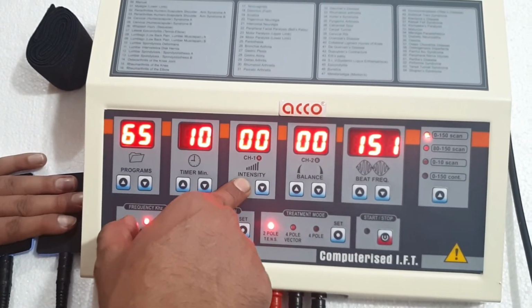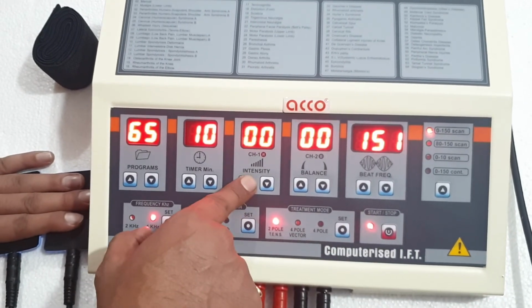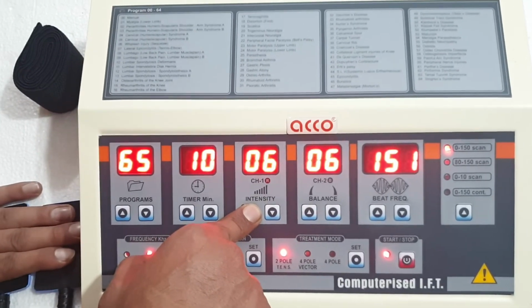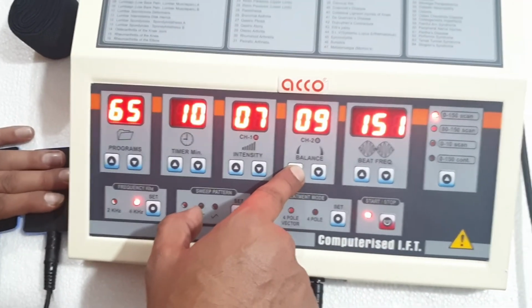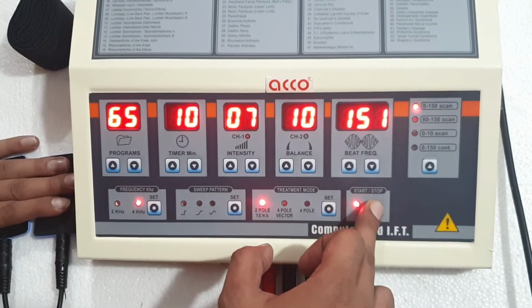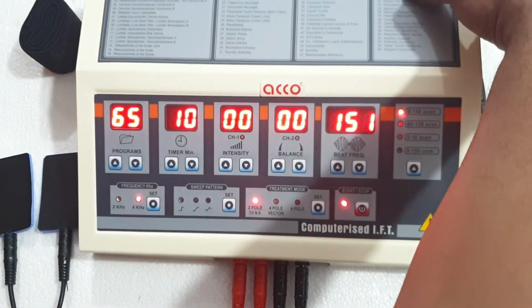Now you can increase the intensity. Once the treatment is completed, switch off the machine.